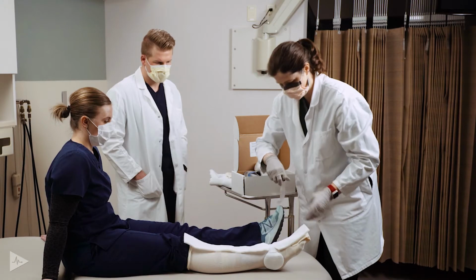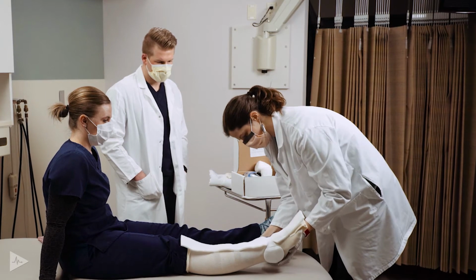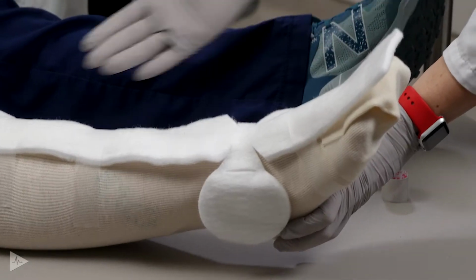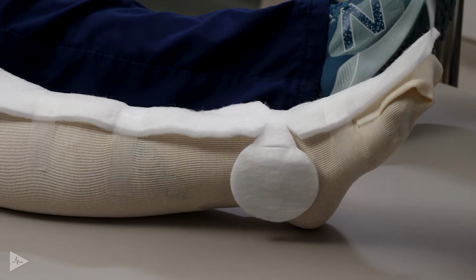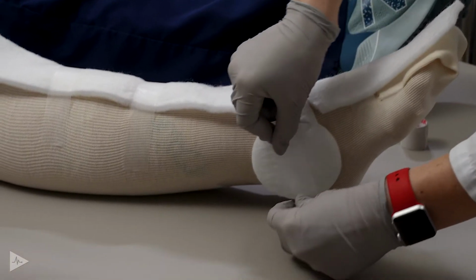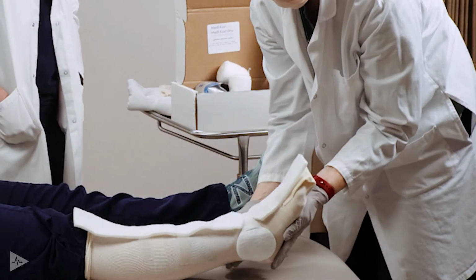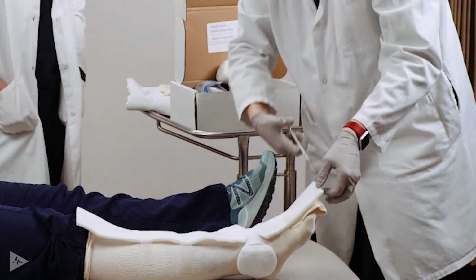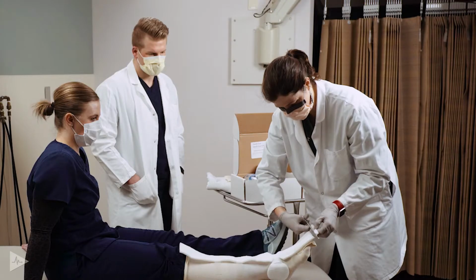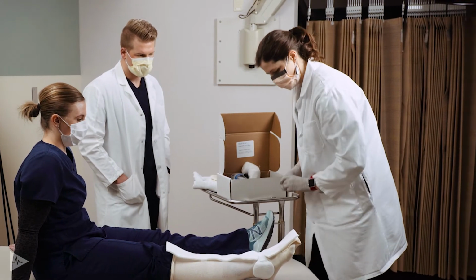Again, you want to make sure that your tape is not entirely encompassing the extremity and is not crisscrossing. So on this side, the tape went higher, and so on this side, we'll have the tape come around a little bit lower, and you can develop your own techniques for applying that. So then in the back of the leg, the tape is not crisscrossing at all. We have a little excess at the toe here that can be trimmed as needed, and in later steps, the excess at the proximal aspect will be folded into the rest of the cast.